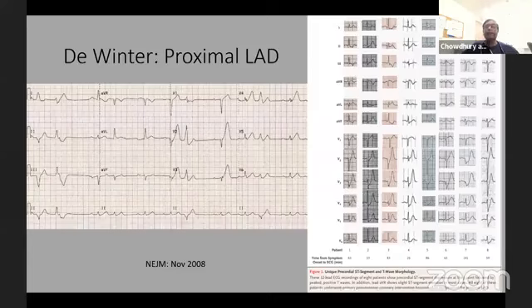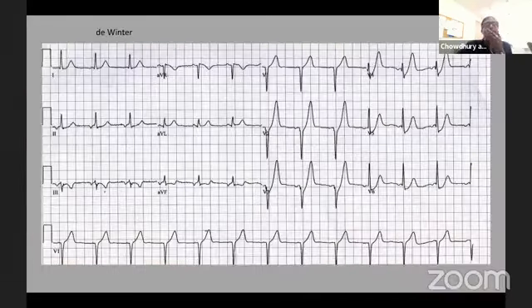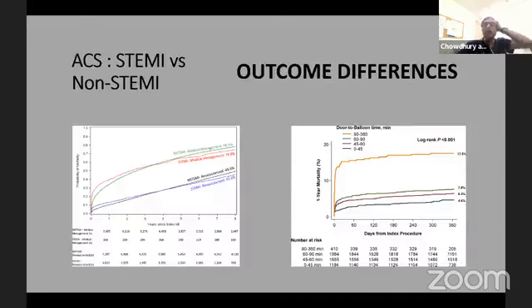So proximal LAD is a very important issue to think about, because if you look at any studies, LAD involvement in the equation of taking care of acute coronary syndrome, left main and LAD have the highest morbidity and mortality. So with having said that, everybody will recognize this, by the way, the number has gone up to more than 100. Tushar, thank you so much. ST elevations, and this is LAD. And this is important to recognize, right? And why I'm saying this?